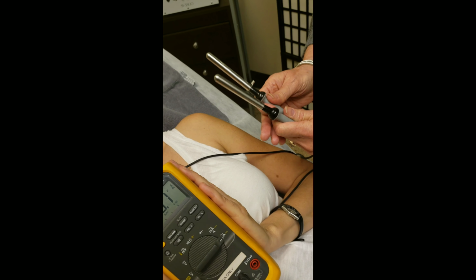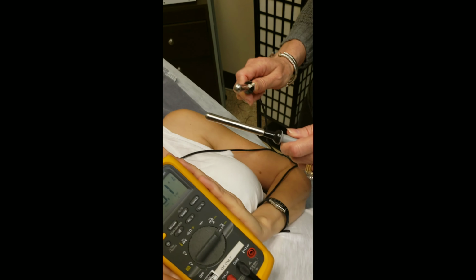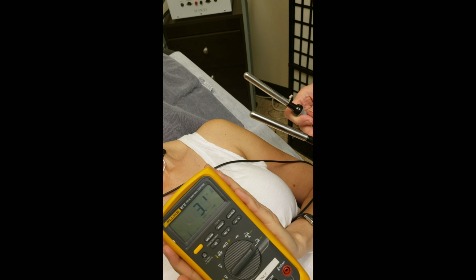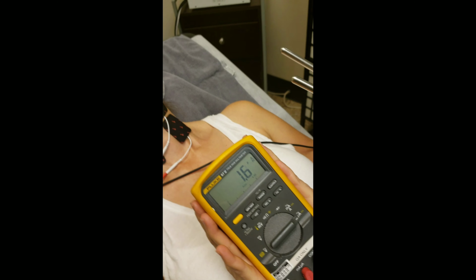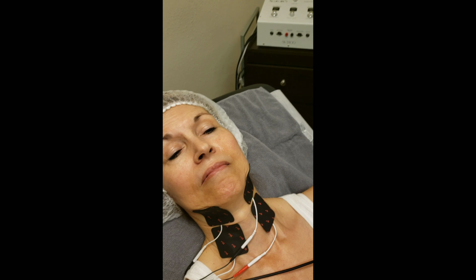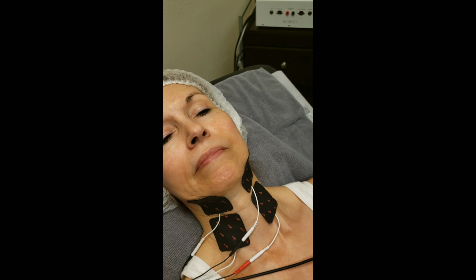But go ahead and tap the probes together just to show everyone that we are connected to the probes. So you can see that the meter is actually registering when the probes do touch. So what we're going to do, our concern is we actually want to see the current that is being delivered to the skin. So Patricia, we already have the pads connected to the skin. Let's go ahead and now touch the probes to the skin.